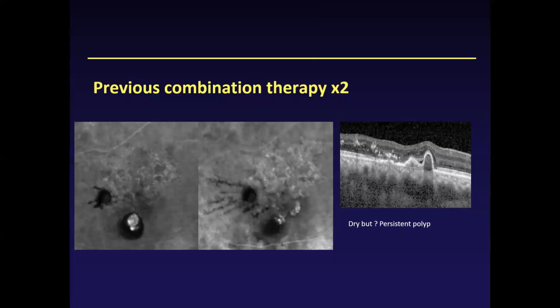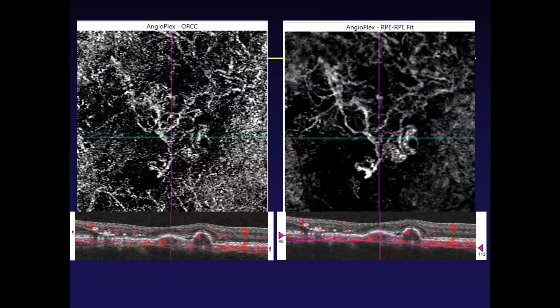So, as I mentioned, if you already suspect an eye has neovascularization, often in my practice, I would still continue to do an FA-ICG at baseline to document the lesion. The difficulty is that once we've started treatment and the eye has dried up, vision has improved, then one feels a bit reluctant to repeat the FA-ICG, but still I want to know whether there is still neovascularization and particularly whether there is still polypoidal lesion.